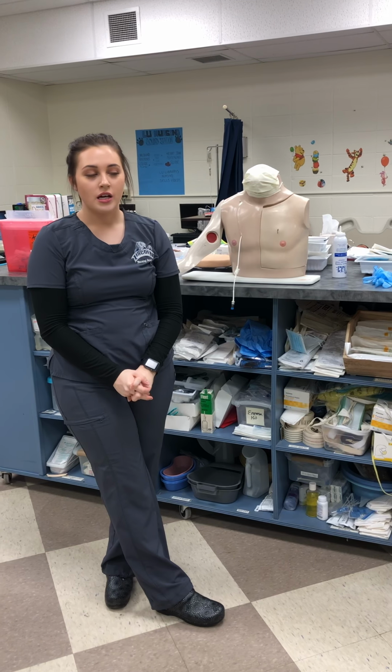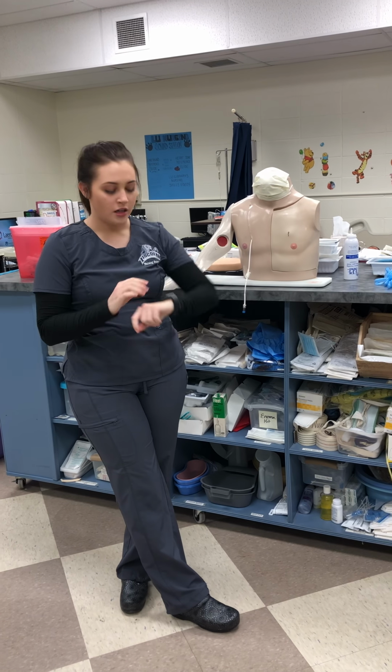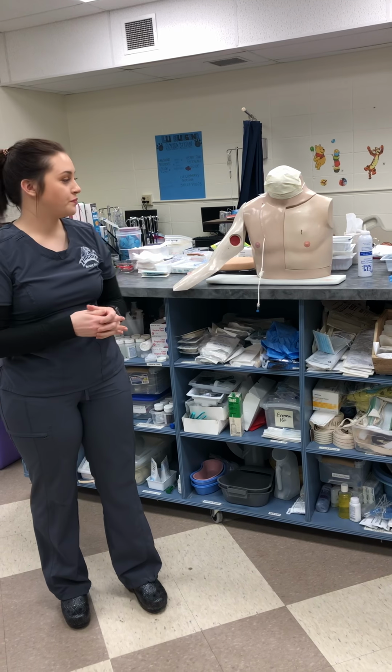My name is Mackenzie, and today I'm going to be accessing a port on a patient. For demonstration purposes, I'll be using this mannequin. Today is January 23rd, and it's 10 o'clock in the morning, and I'm going to go ahead and get started.